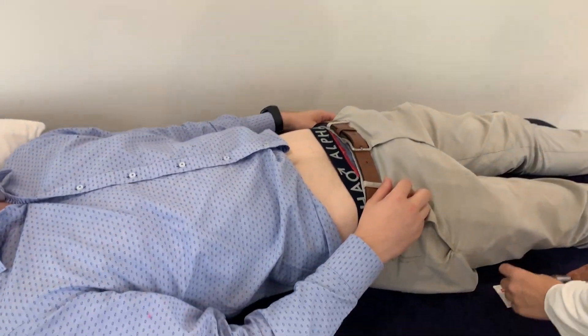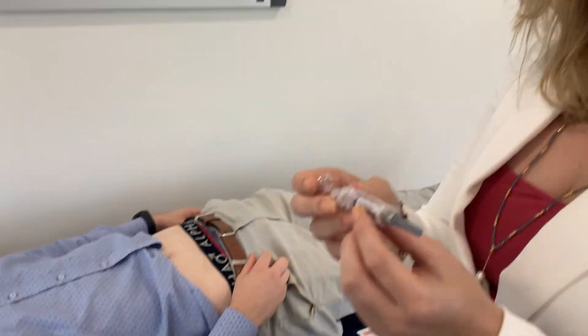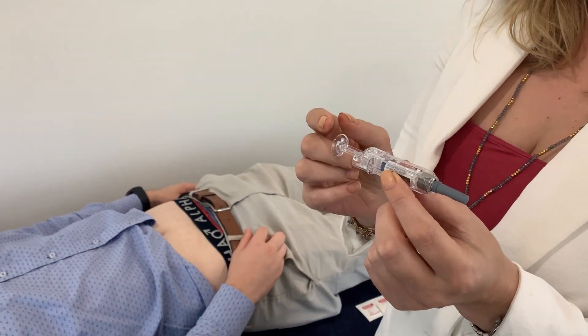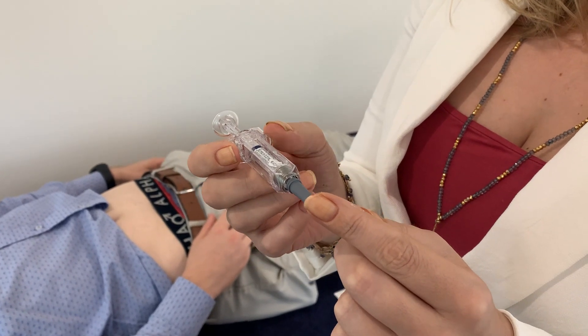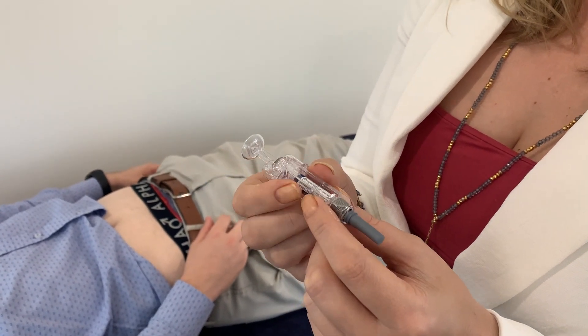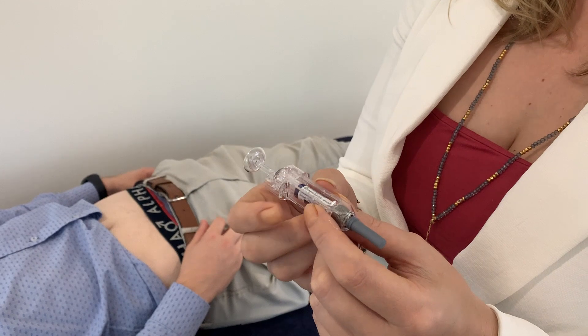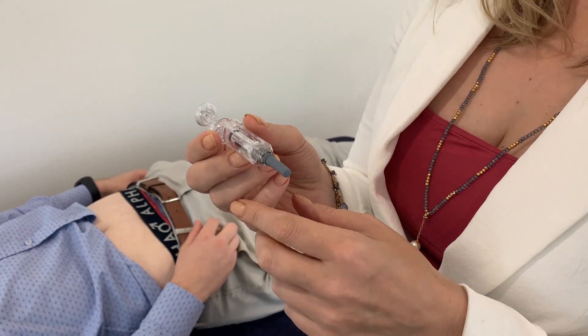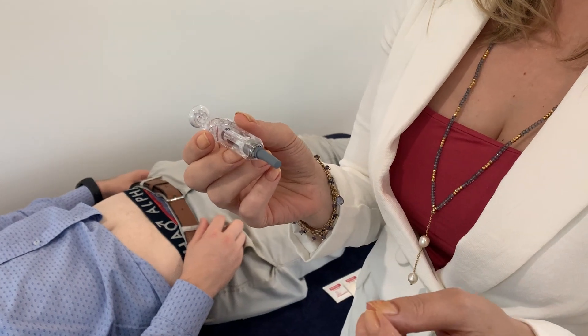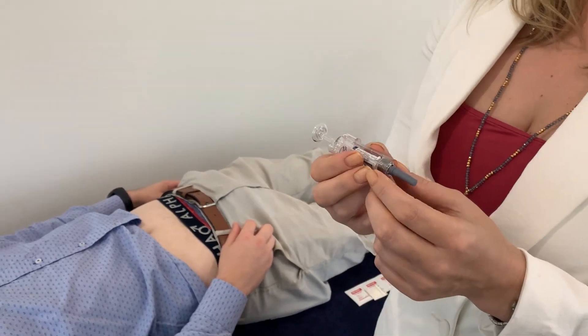First of all, put everything down like that. The syringe comes like this — that's the plunger that pushes the needle in, and this is the little bit that covers up the needle. You want to take that off, but be careful how you do it. Don't grab both ends and pull at the same time, because when that comes off you'll end up injecting everything out of the syringe onto the floor, and that will be very disappointing. So you hold it here and then you take it off like that.